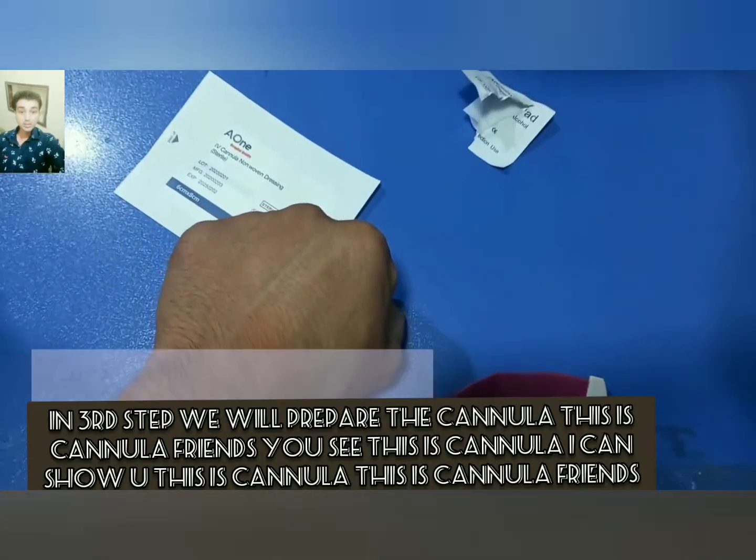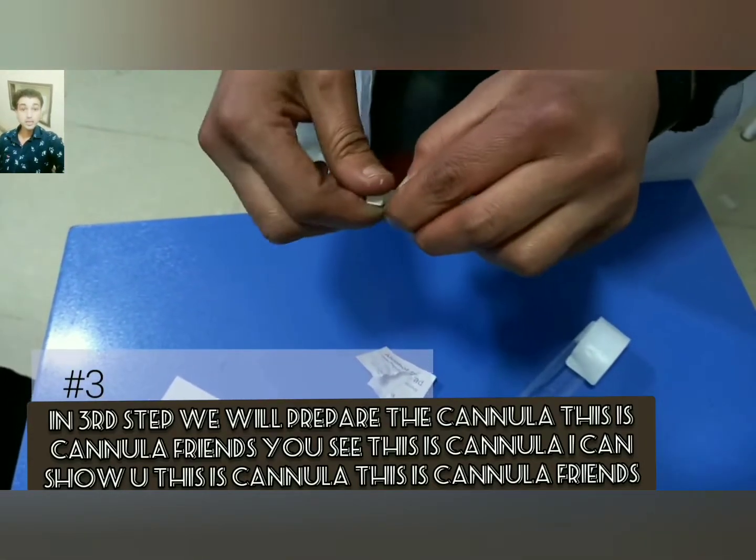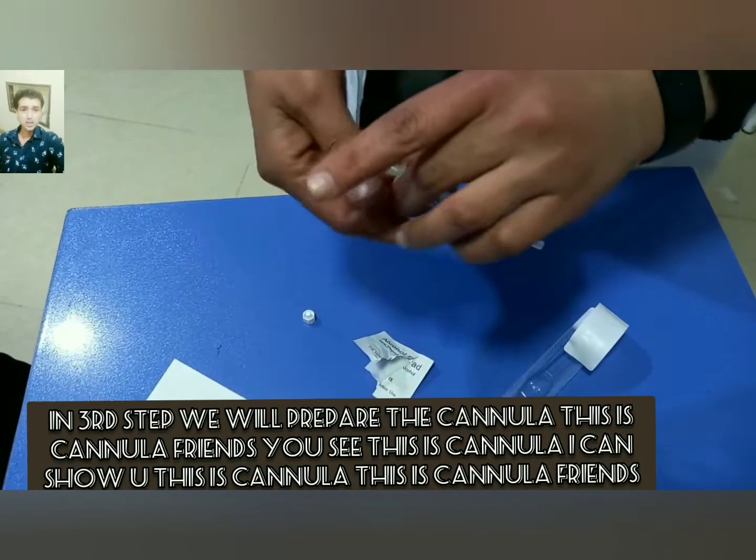In the third step, we will prepare the cannula. I can show you — this is the cannula.